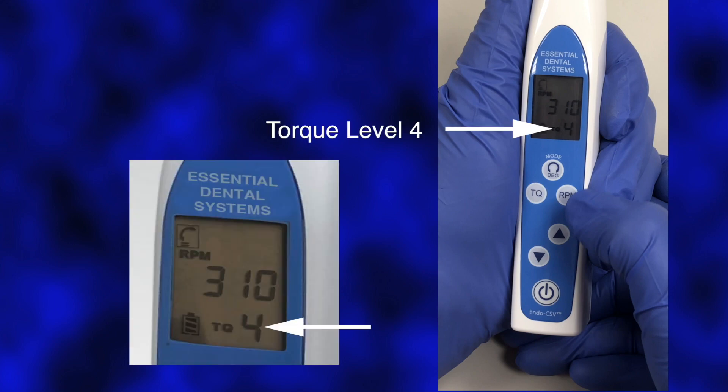Press the Torque Limit button, then select between five torque level settings by pressing the up-down selection buttons until the desired level is selected. Select a torque level of 4 for use with the SafeSiders HF instruments.